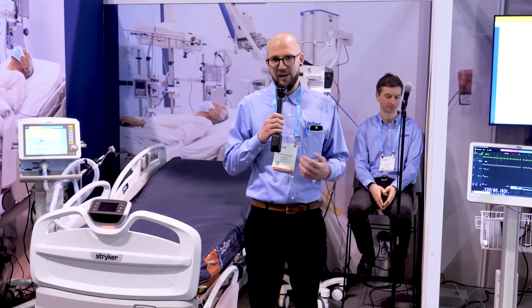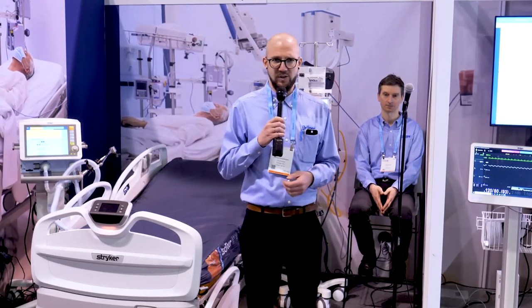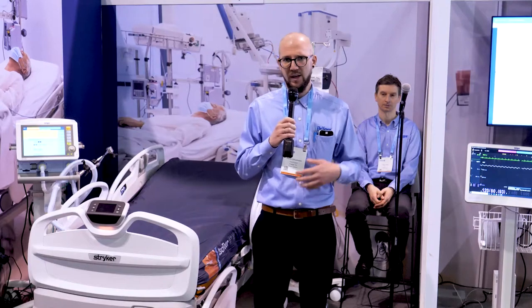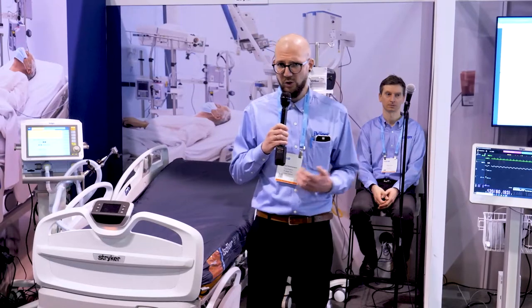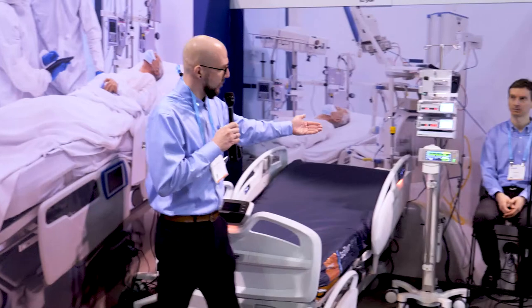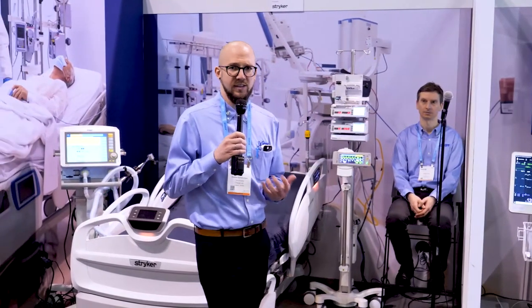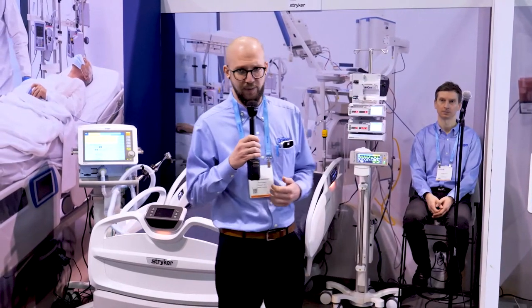Hi, my name is Dennis. Jerry shall receive non-invasive ventilation trials up to four times a day for pneumonia prophylaxis and his diaphragm training. His whole treatment is supported by a multi-modality system concept which contains a Draeger ventilator, a Draeger patient monitor, and Akkomet syringe pumps for infusion therapy. All these devices use the IHE SDPI profile to gather data into the anteroom where the point-of-care cockpit is placed.